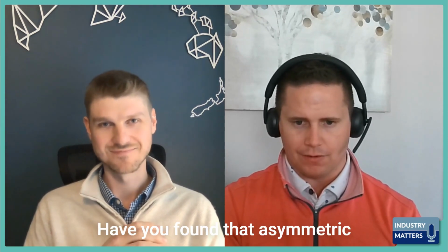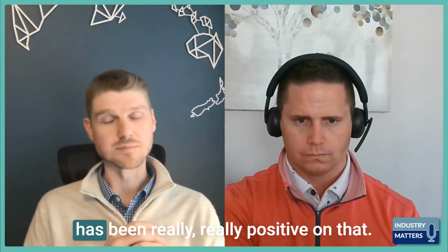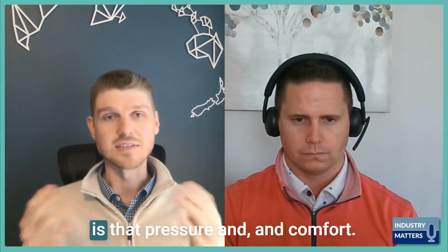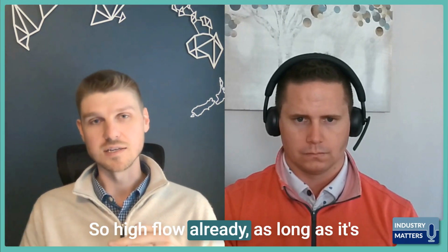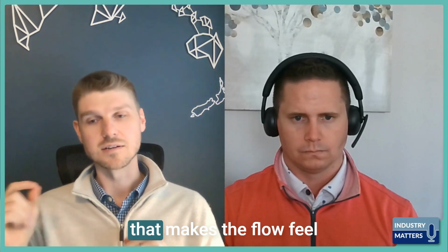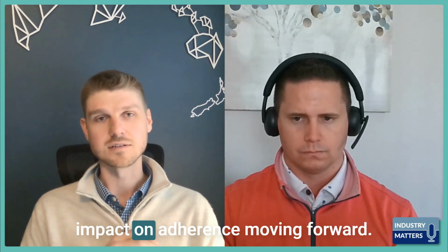Regarding the comfort piece, one of the biggest challenges with our chronic respiratory support is, as you mentioned, adherence. Have you found that asymmetric high flow improves tolerability? Absolutely. Anecdotally, early feedback has been really positive. One of the issues with positive pressure therapies like CPAP or ventilation is pressure and comfort. Patients don't want to feel that on their face. High flow, as long as it's high humidity, is typically quite comfortable, especially in the home care space at more moderate flow rates. Then you add a cannula that makes the flow feel even more natural and is quieter. Absolutely, I think that's going to have a huge impact on adherence moving forward.